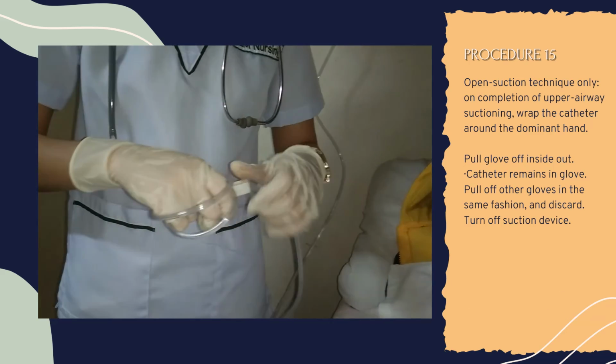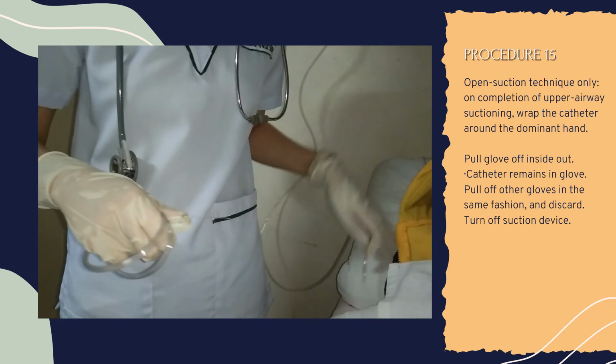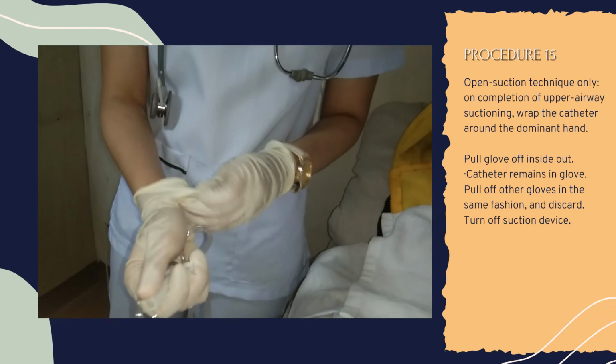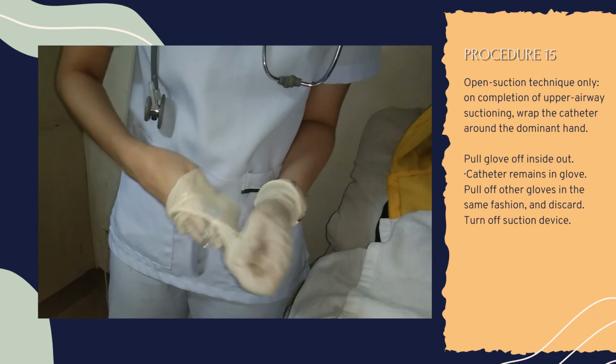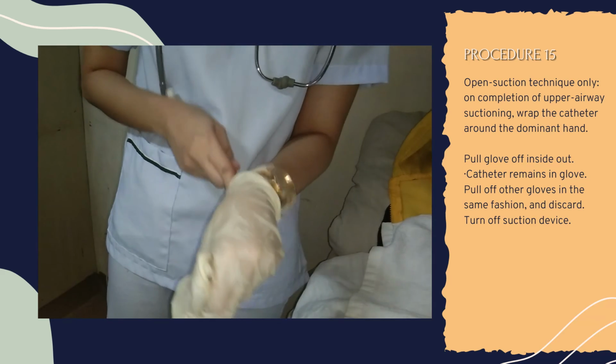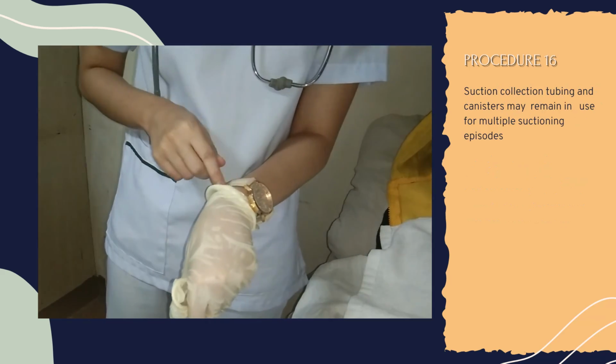In open suction technique only, on completion of upper airway suctioning, wrap the catheter around the dominant hand. Pull the glove off inside out. The catheter remains in the glove. Pull off the other glove in the same fashion and discard. Then turn off the suction device. This reduces transmission of microorganisms.